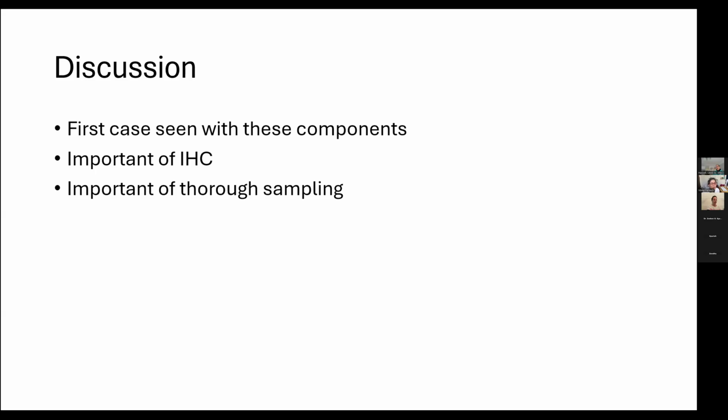I think the biggest issue is occasionally on frozen section, where it's very easy to miss an immature component of a teratoma. But in general, the small blue cells of neuroglial tissue are usually admixed with other glial tissue and or other soft tissue elements.